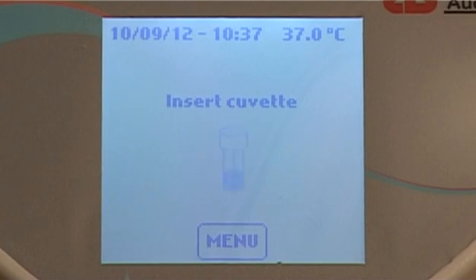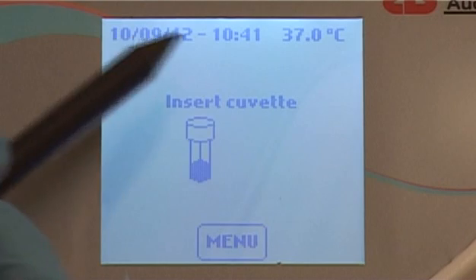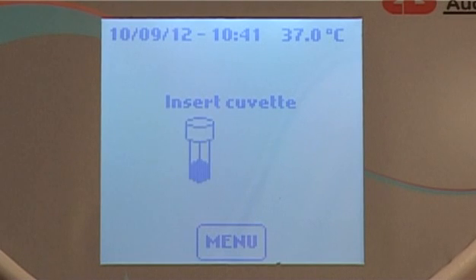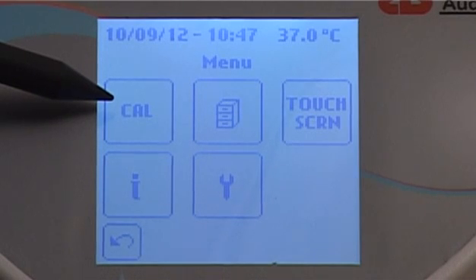When the warm-up is over, the instrument will display the start screen. The screen will display the date, time, and actual temperature of the cell. From the start screen, the user can choose to perform a test or access the main menu of the system. The Cal icon provides access to the Calibrator status menu.